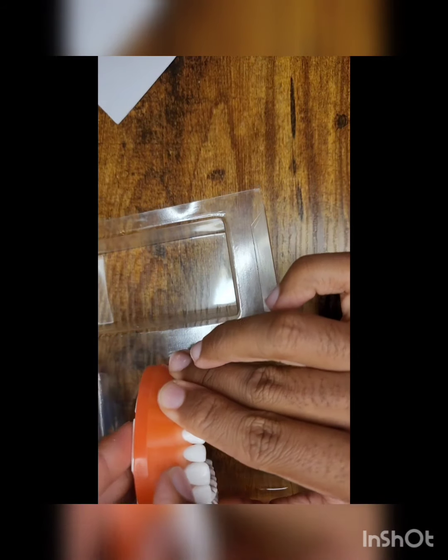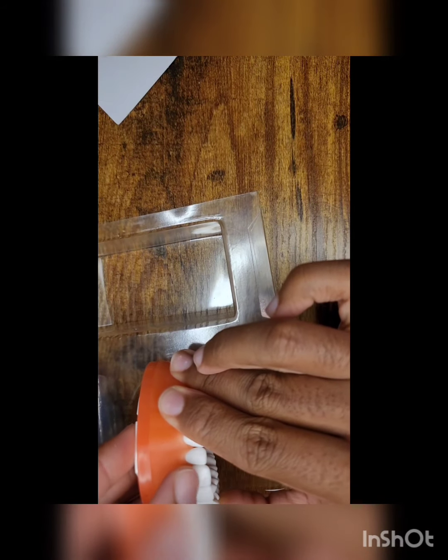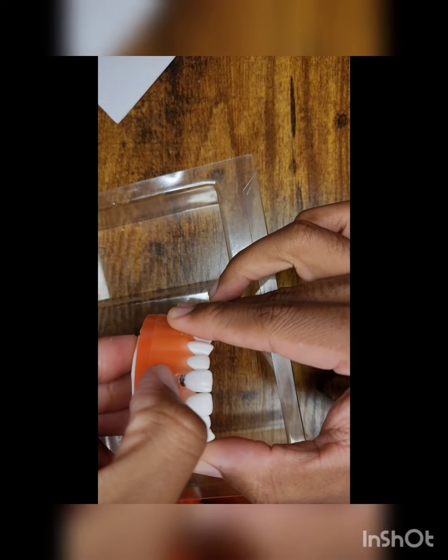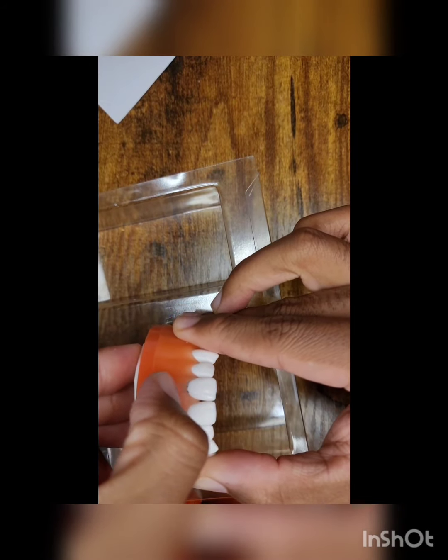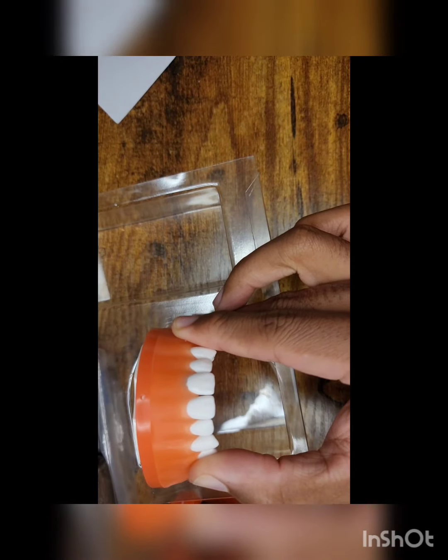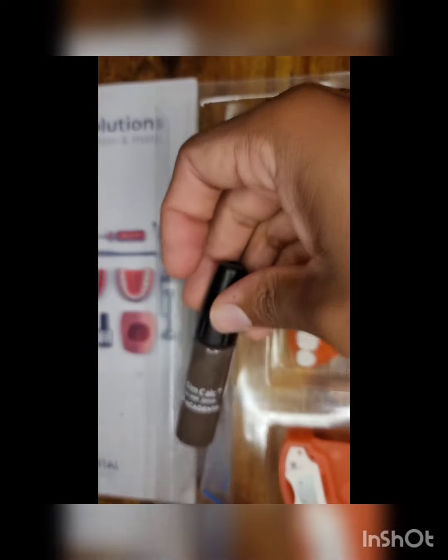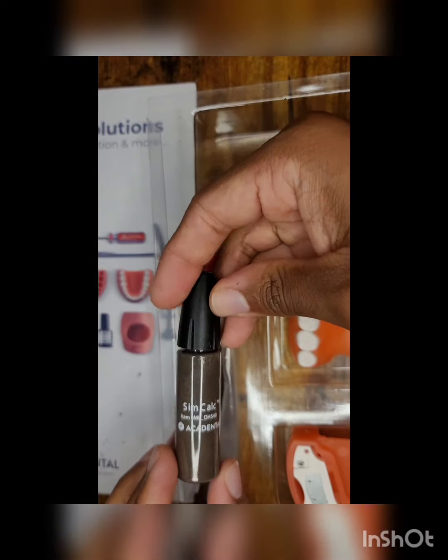You can actually easily, with the probe, go about 3 millimeters. There is some simulated calculus that I have applied. The depth is about 3 millimeters easily, but a maximum of 5 millimeters. And here we have the simulated calculus.